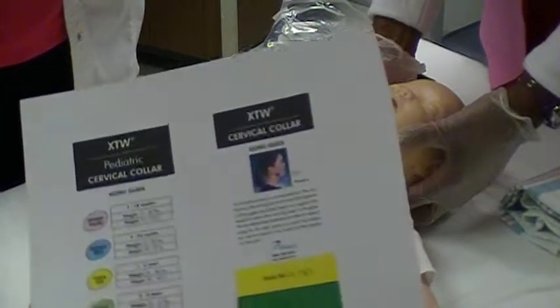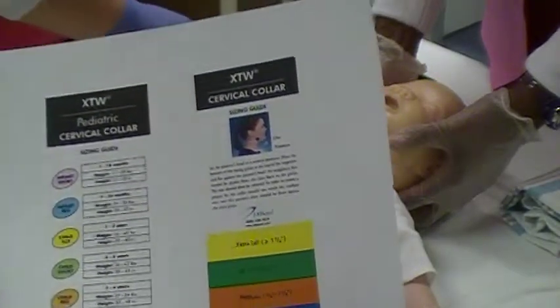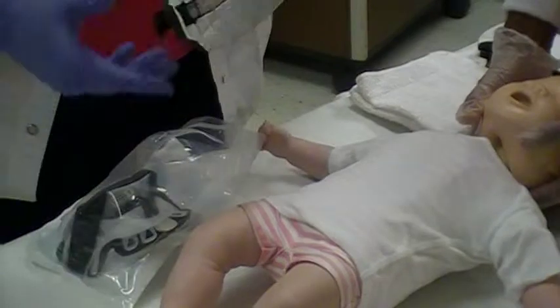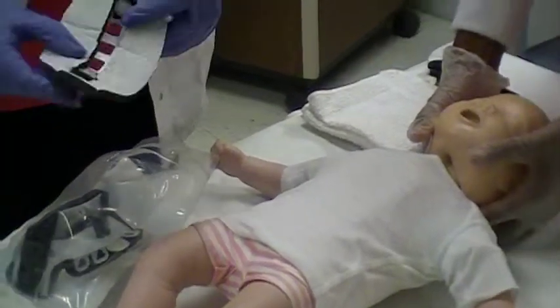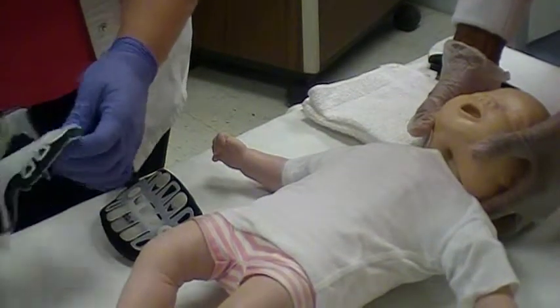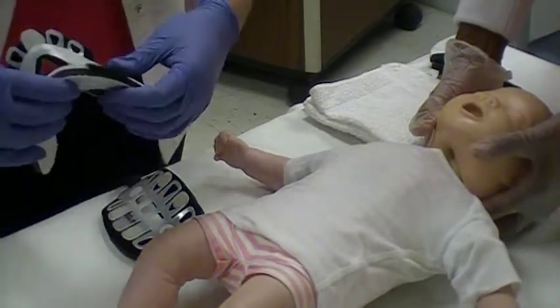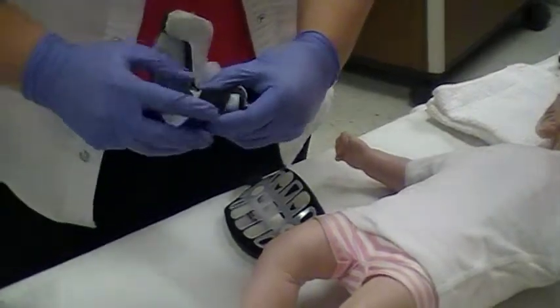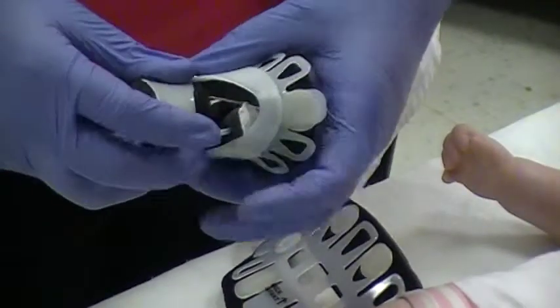Remove the selected collar from the packaging and ensure that the padding is secure. Separate and identify the front and back panels of the collar. Roll front and back panels inwards with both hands into a cylinder to preform the panels.